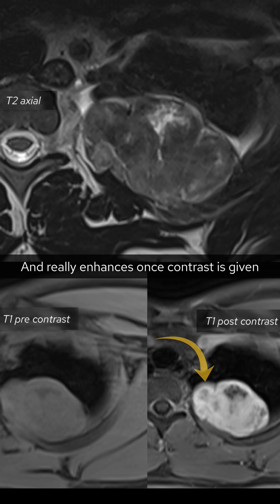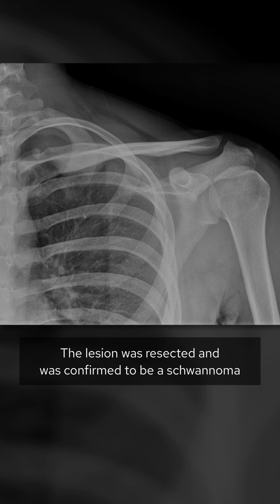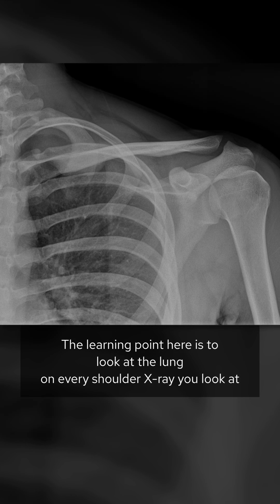An MRI was performed, and the lesion has an almost tubular appearance and really enhances once contrast is given. The lesion was resected and confirmed to be a schwannoma. The learning point here is to never forget to look at the lung on every shoulder x-ray you look at.